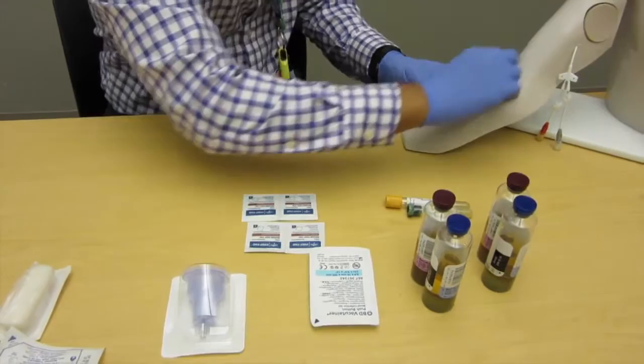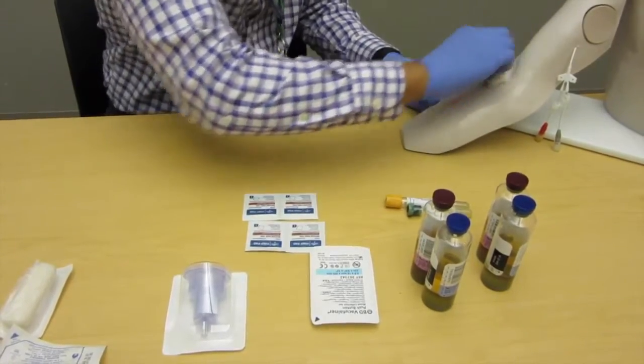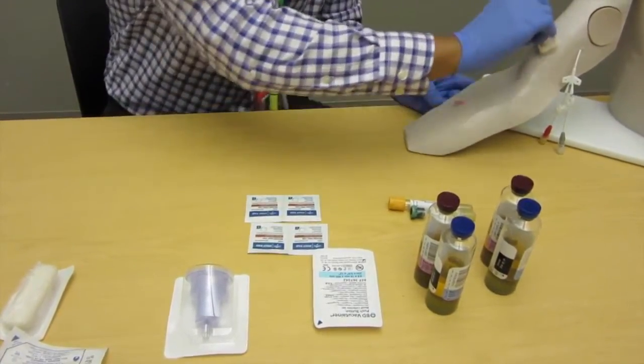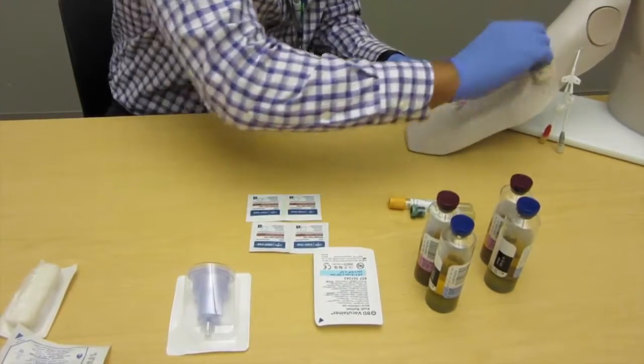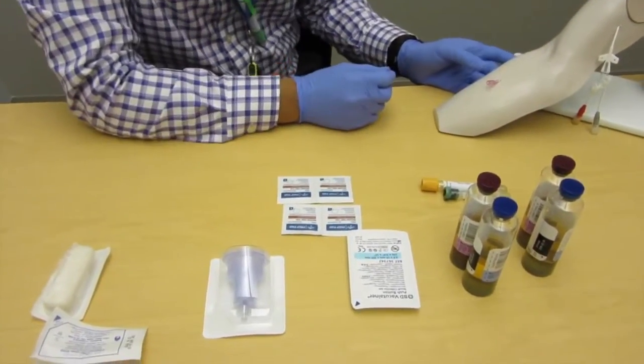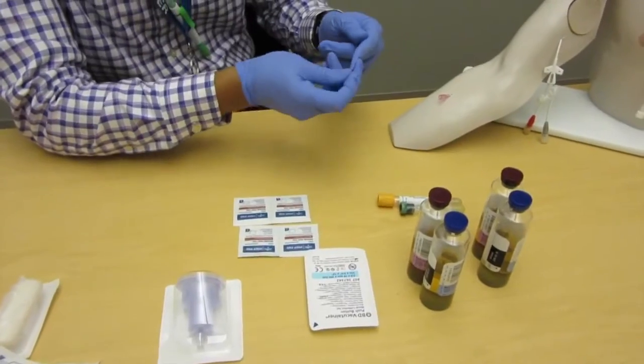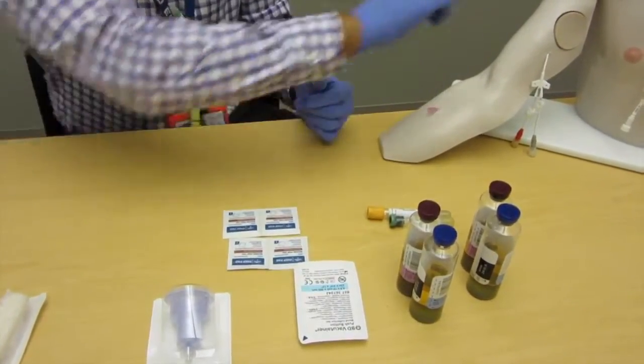Please make sure you go the entire 30 seconds. As I mentioned earlier, I'm not actually going to puncture this arm—it's not equipped for that—but proper technique is paramount. It is 30 seconds.